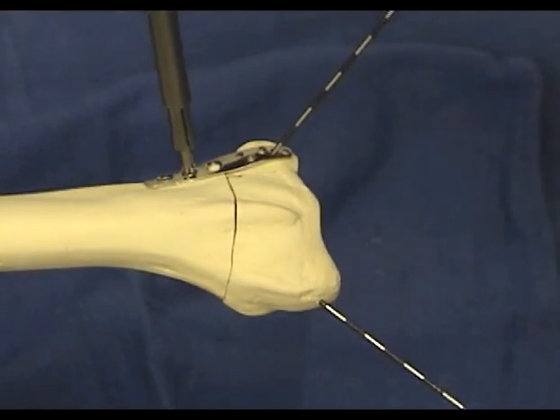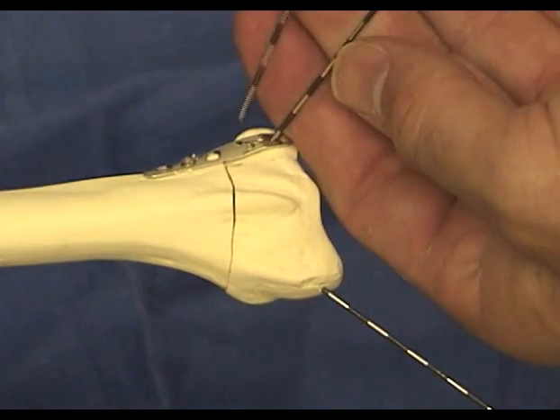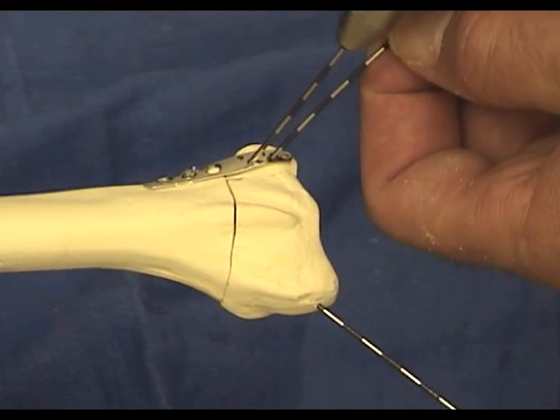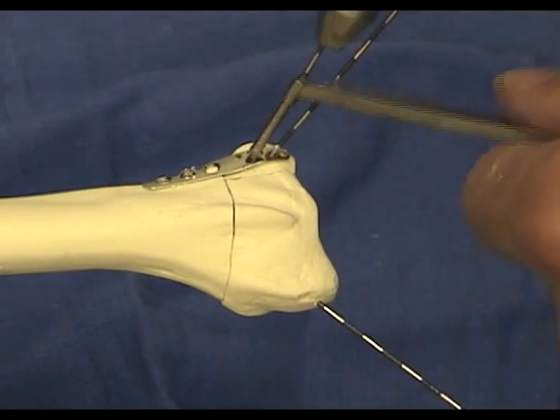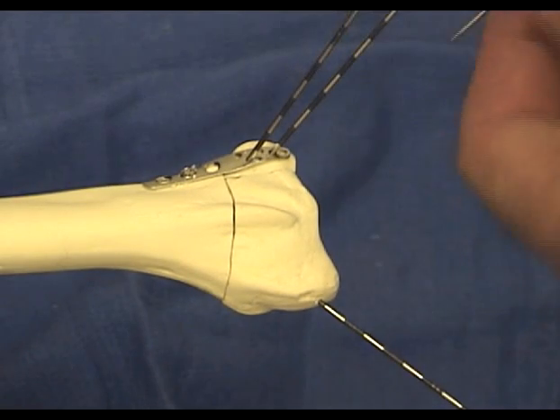If the ulnar corner fragment is large enough, a second pin is inserted, skipping a pin hole. A useful trick is to insert the pin until it hits the far cortex, then use a drill sheath as a drill stop so that the pin is placed only a millimeter or two beyond the far cortex. Adjacent pin holes are drilled with a zebra pin for insertion of the pin hooks.